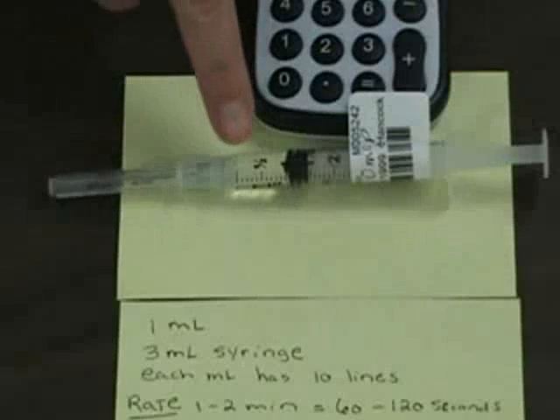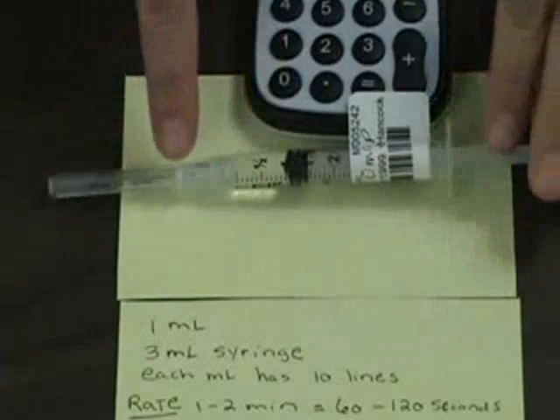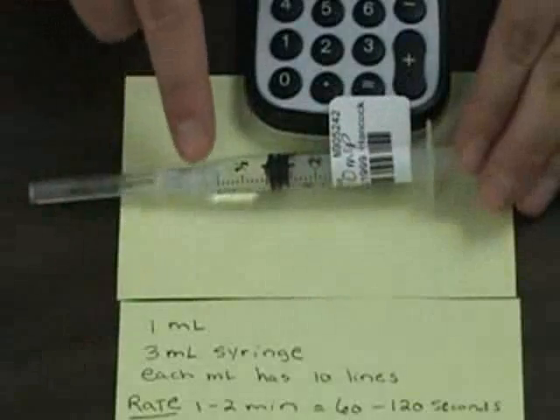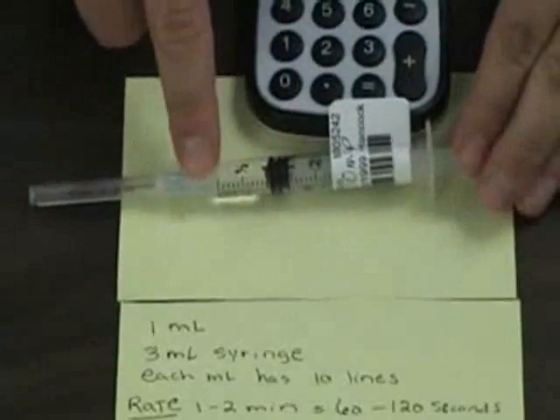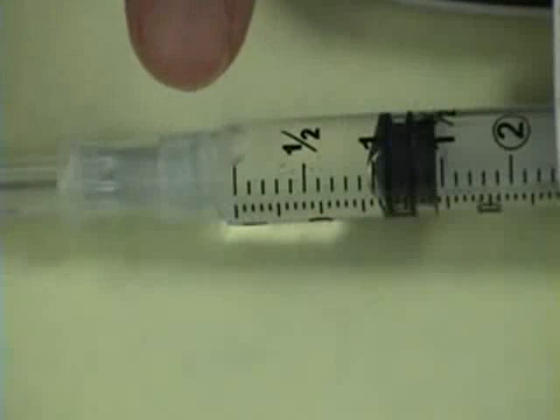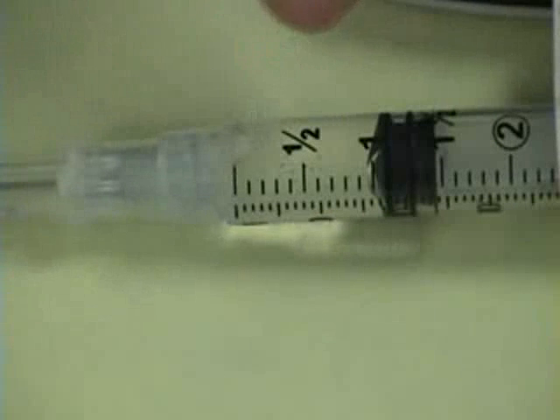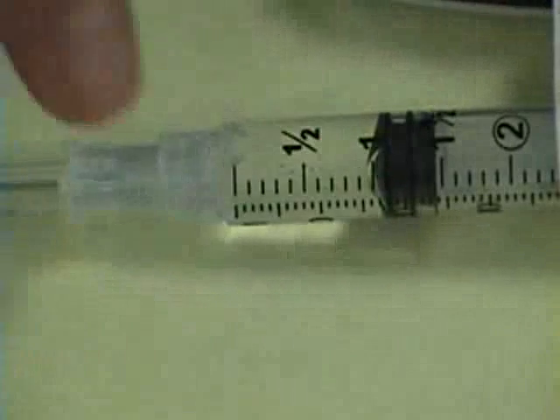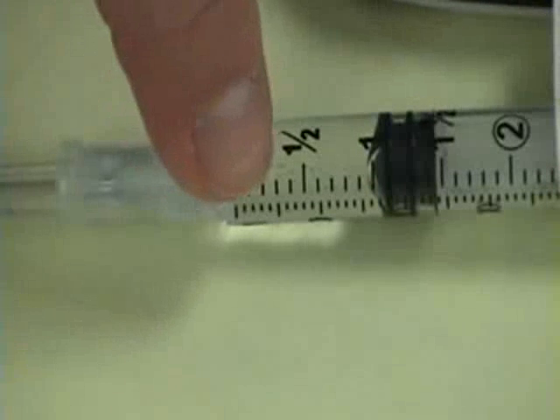I have 1 ml of medication. I have selected a 3 ml syringe as the appropriate size. Each ml on this 3 ml syringe has 10 lines. I want to look at the markings that have the 1/2 ml, the 1, the 1.5, the 2 mLs, not the numbers that are on the other side of the syringe. And I will be counting each one of these lines.